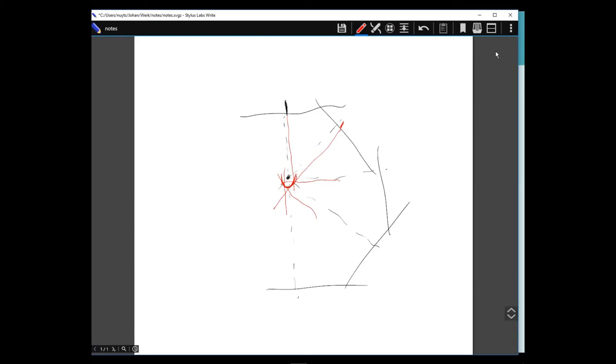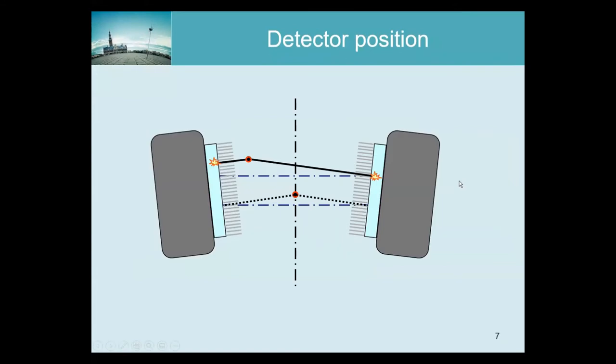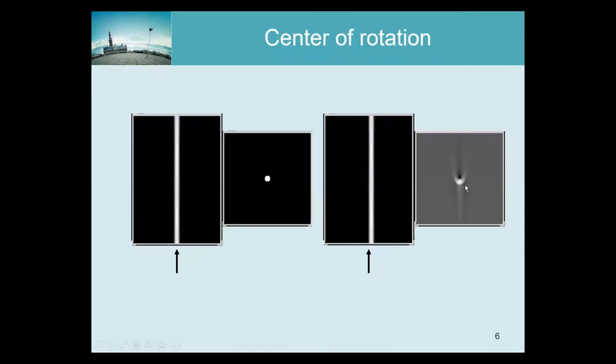And that's what you see here. So this line is tangent to all these back projection lines. And then if you look at neighboring lines, then they will see too much activity. And that's why some negatives are put here to partly compensate for the excess positive activity that was needed to make those lines happy. So the whole thing is crappy.